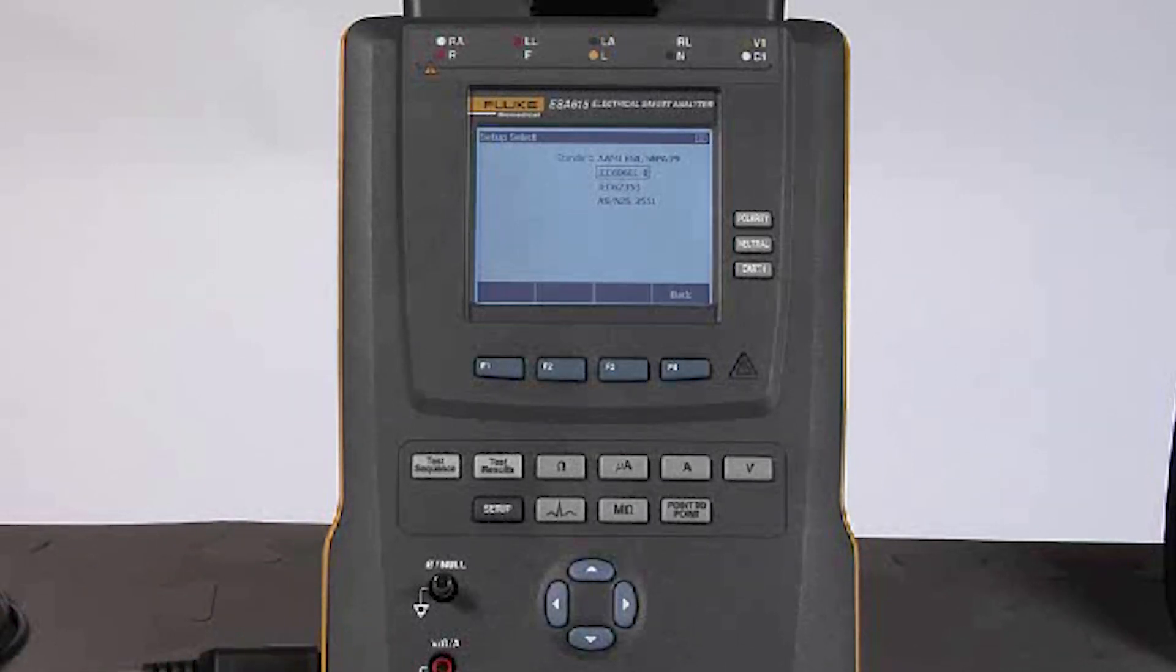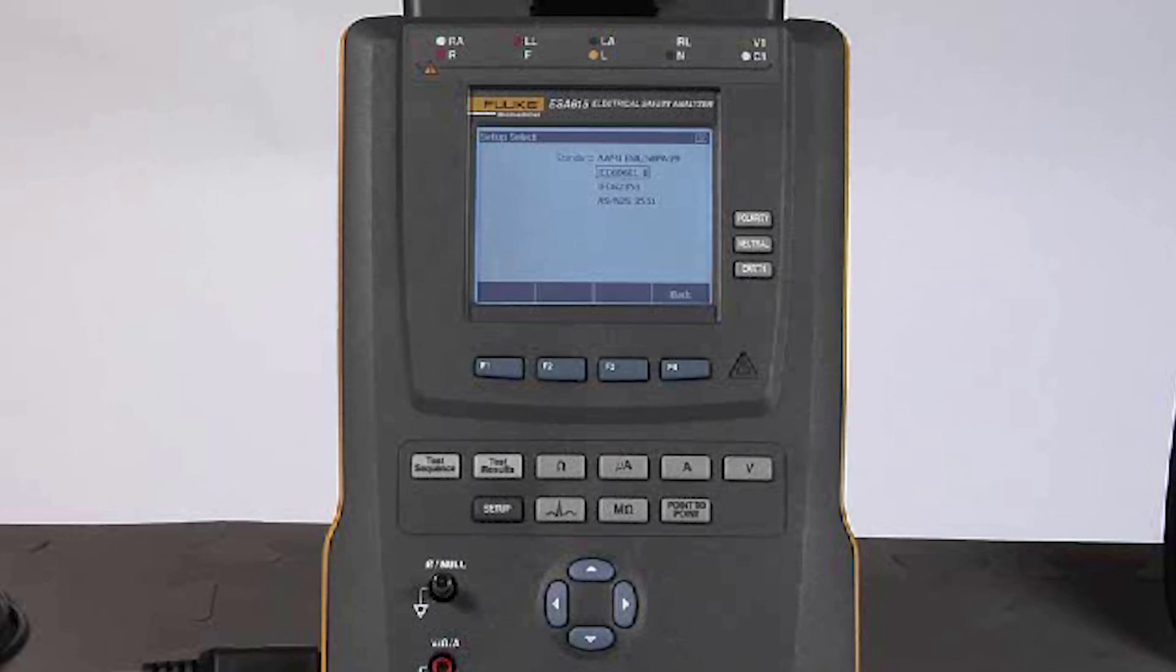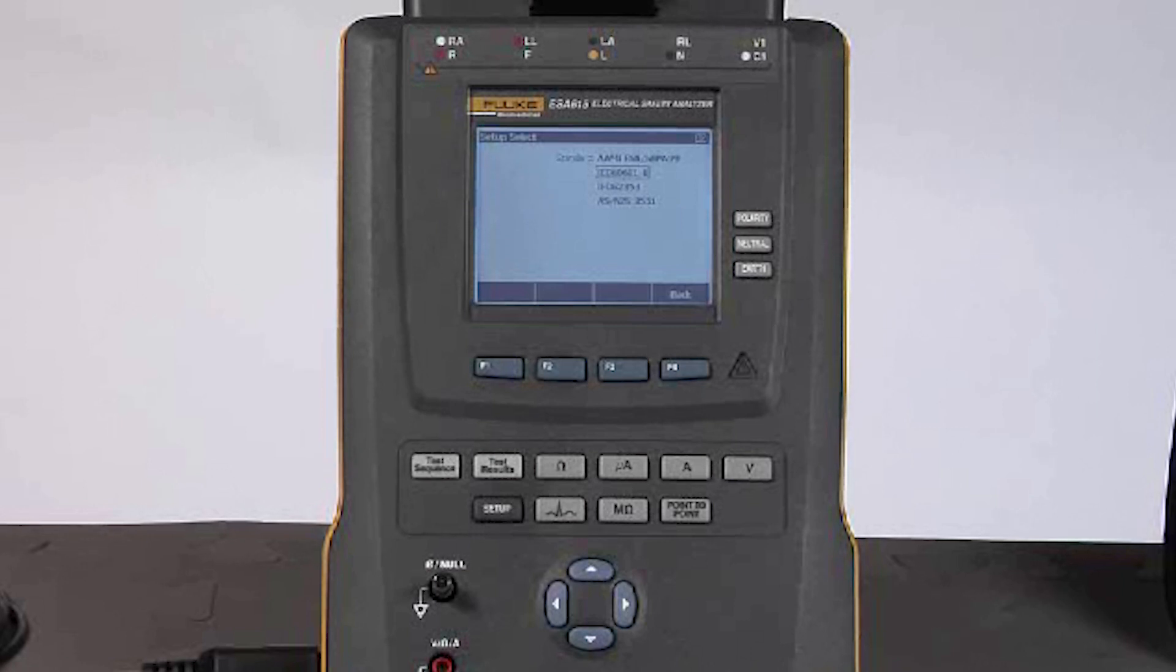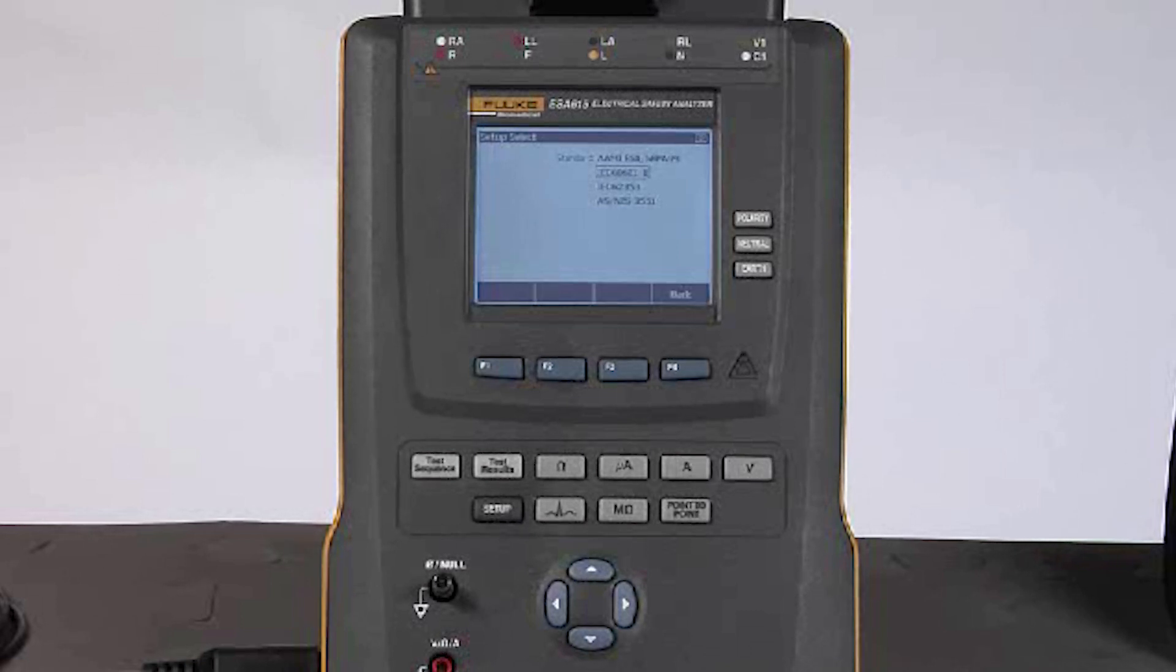The rest of the controls on ESA 615 should look very familiar to you as they are the same as those buttons you will find on ESA 612 and ESA 620. So there you have it—the ESA 615 automated electrical safety analyzer.